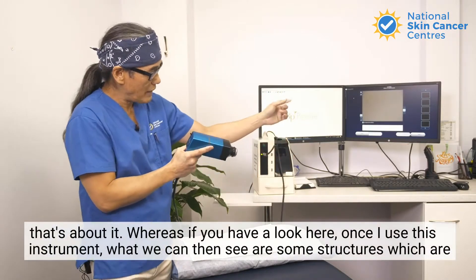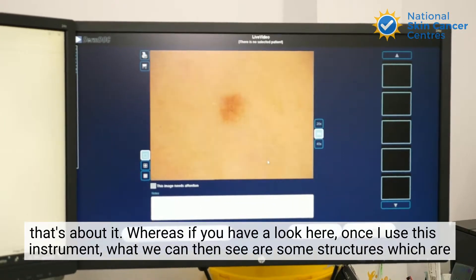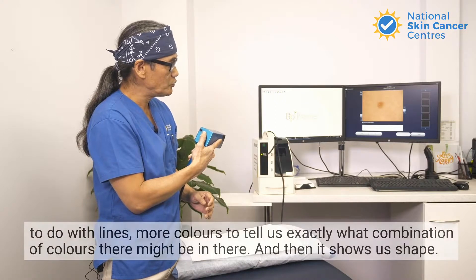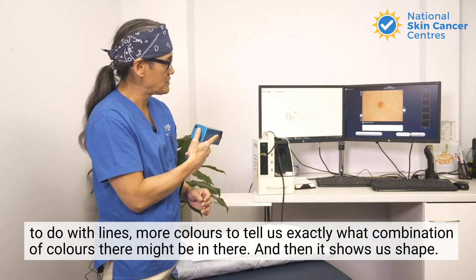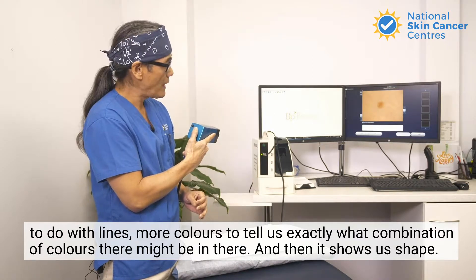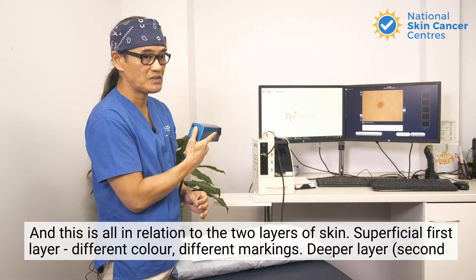Whereas if you have a look here, once I use this instrument, what we can then see are some structures which are to do with lines, more colors to tell us exactly what combination of colors might be in there, and then it shows us shape. This is all in relation to the two layers of skin.